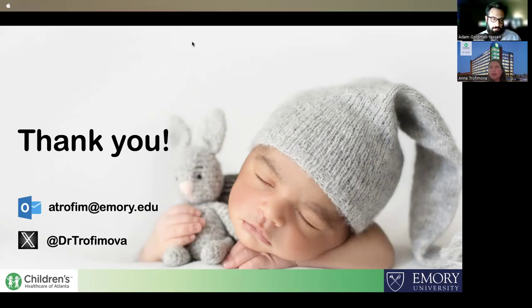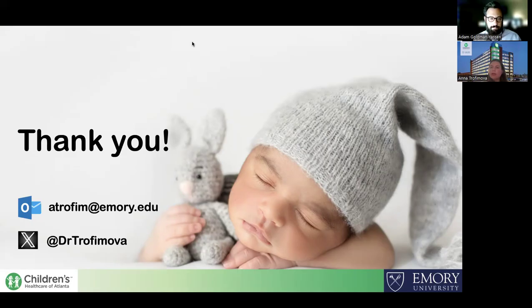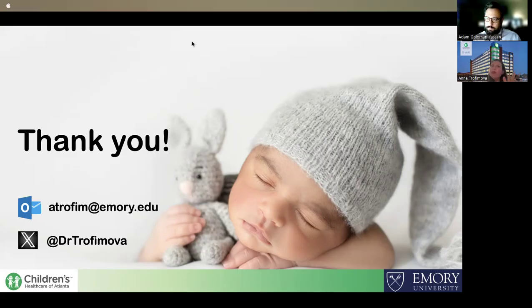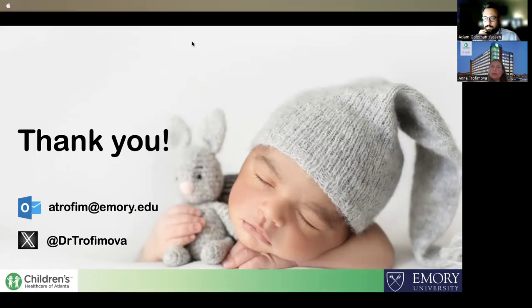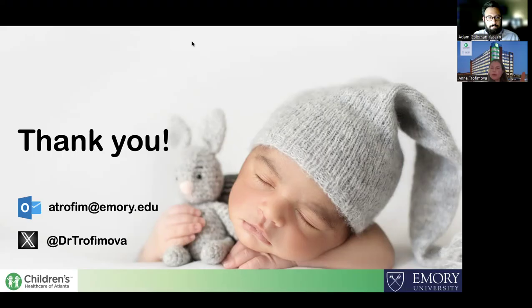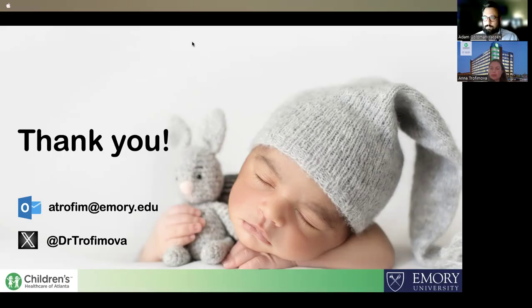Those are going to be the only circumstances when I may put a disclaimer that maybe we're within that time window where the imaging findings are obscured, and obtaining a follow-up MRI will be helpful to further evaluate. So that's probably the only scenario where I might put a disclaimer and recommend a follow-up. In the majority of cases, if the MRI looks good and there is no significant discrepancy between the clinical course and findings on MRI, I do not.